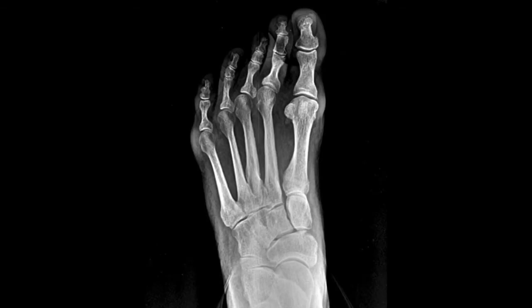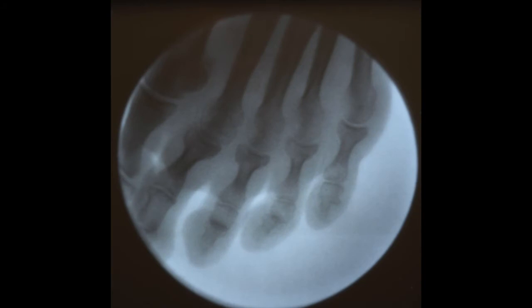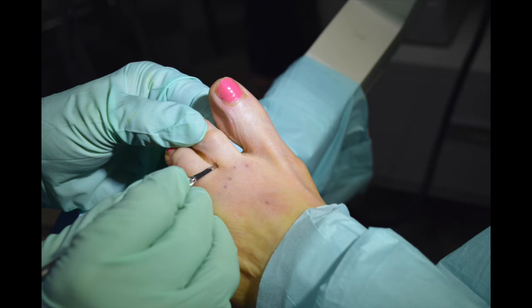The patient had deformities in the second, third, fourth, and to some degree fifth metatarsophalangeal toes. To correct this, we performed osteotomies of the proximal phalanx and also the middle phalanx in the second and third toe. This allowed positioning of the toes into a more rectus position, taking pain away from the patient.